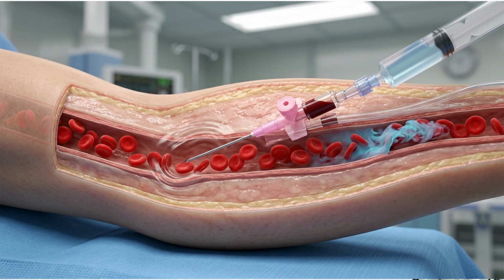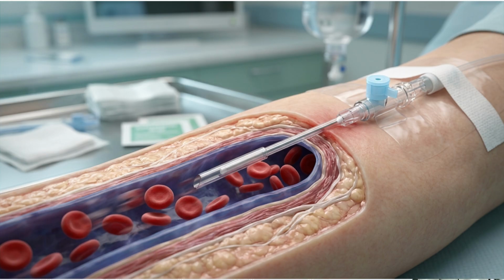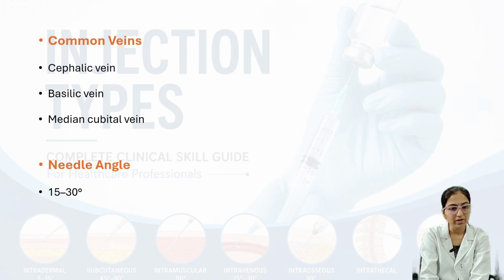Intravenous injection, here medication is delivered directly into the bloodstream through a vein. And then common uses are emergency drugs, IV fluids, blood transfusion, and then antibiotics. And then common veins here: cephalic vein, basilic vein, and then median cubital vein. Needle angle is 15 to 30 degrees.